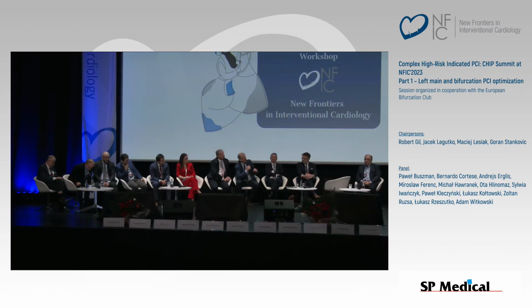No, but that's why I'm saying, the problem is that if you use a smaller diameter, you can keep it open, but then at the end of the procedure you for sure will go for a bigger balloon, and you can do the same actually at the end of the procedure, which sometimes is not very favorable.